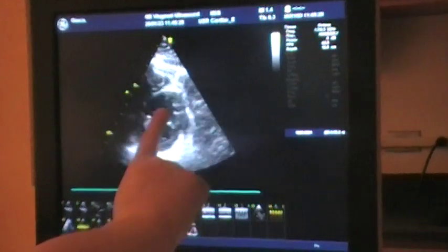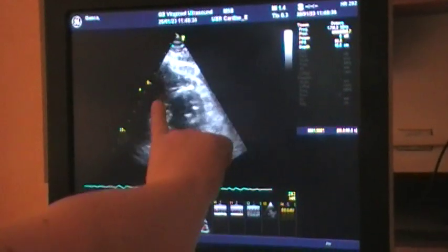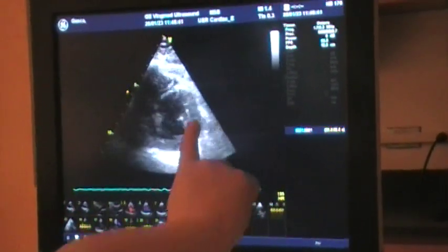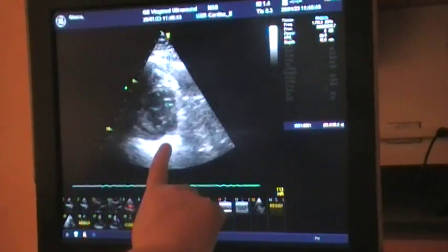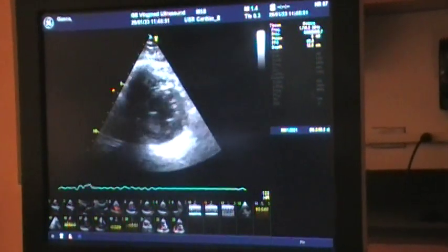If you look at your left ventricle, right ventricle, you can say this is all septum here. So this bottom half would be inferior septum, anterior septum. This would be anterior. This would be anterolateral, inferolateral, and inferior wall here, where this papillary muscle connects. So that's your 6 wall segments.